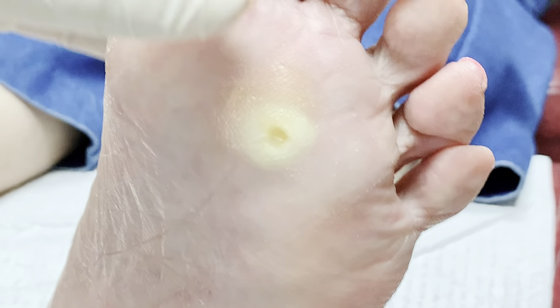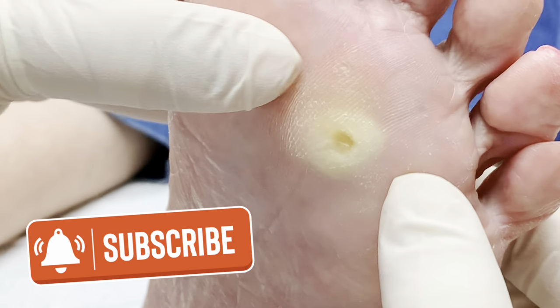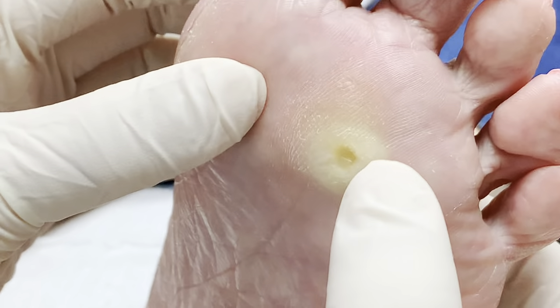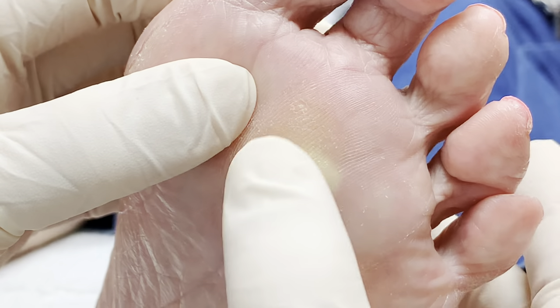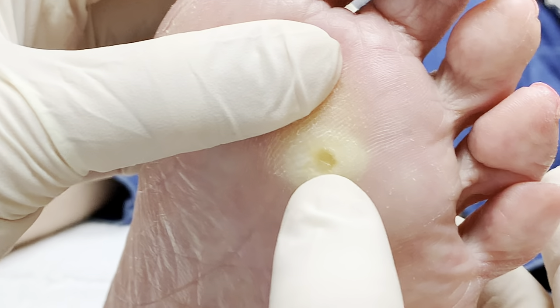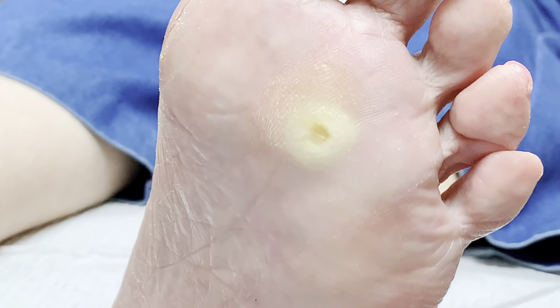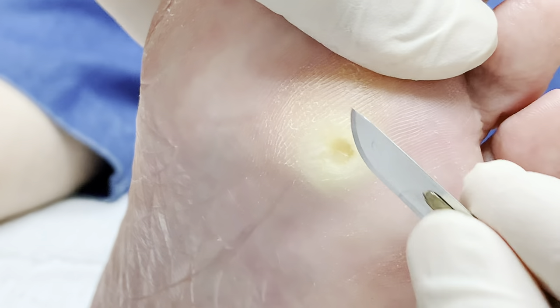We have Vicky here. So Vicky just had a little acid application to this area for a deep-seated corn. And sometimes it causes a blister like this and it becomes quite painful. So I need to clean this out and get this core out. You can see this core here. When it blisters, the whole thing from underneath it pops out, and it takes that whole root out of that area. So it's a good thing, but when this happens, it becomes pretty painful.